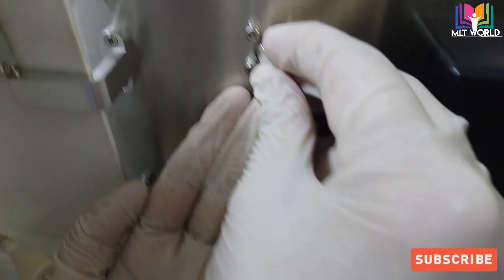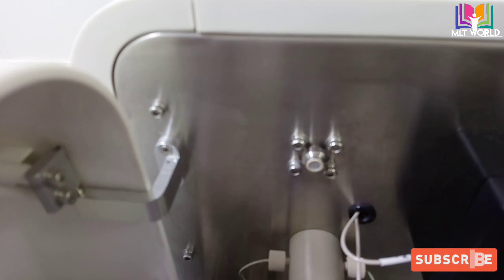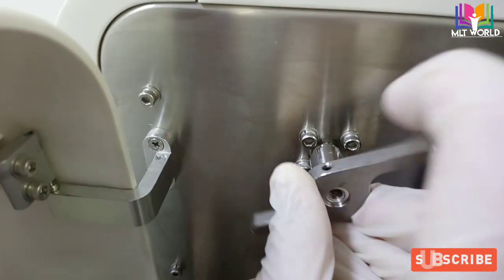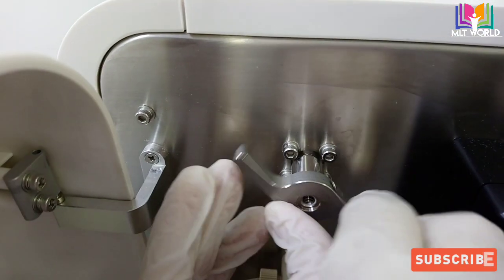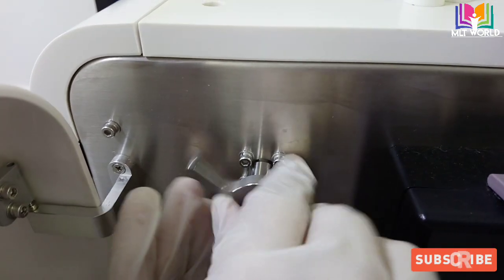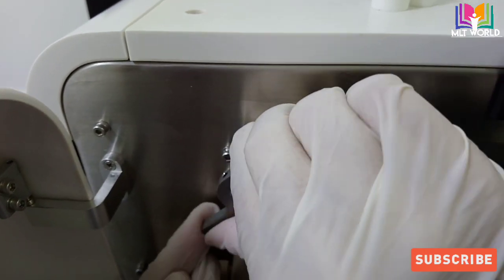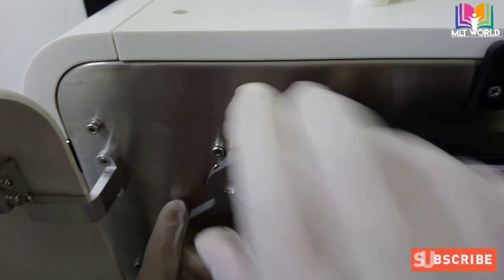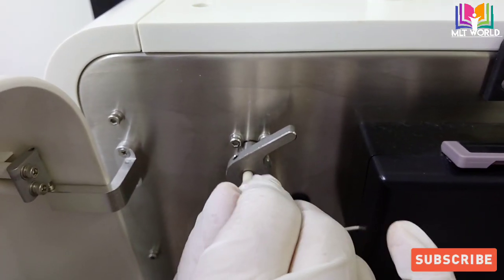We will place the new filter. There is no front or back side — both sides are the same — so just insert it into the filter area in any direction. Then we close the knob, and when closing we move it in the clockwise direction and tighten it.